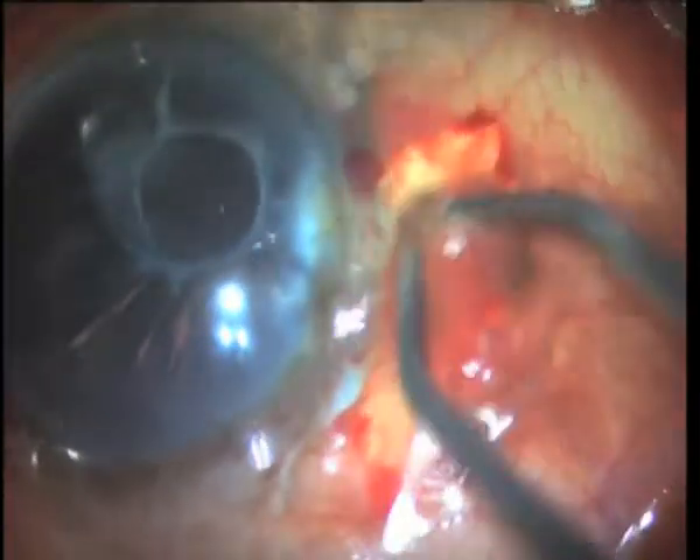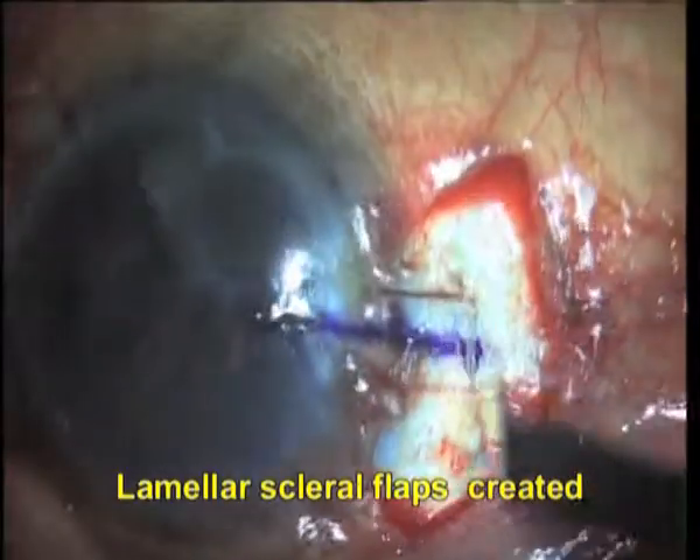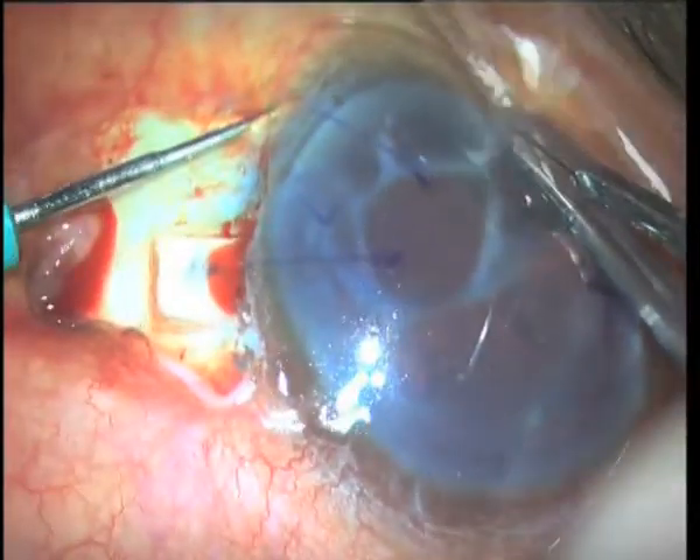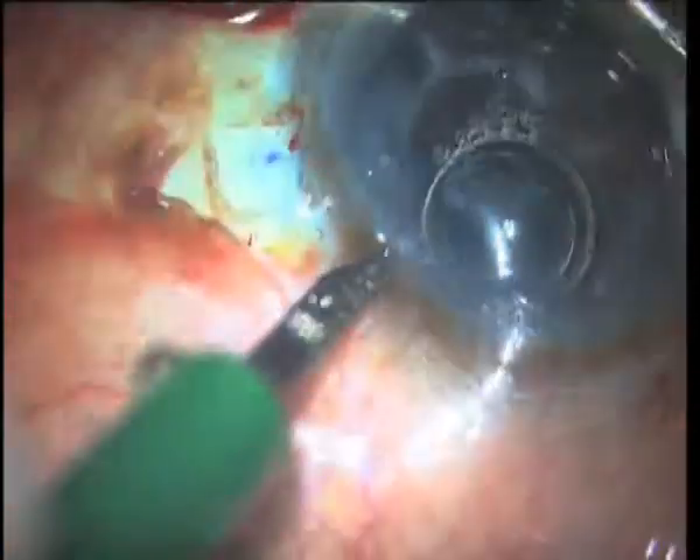We begin with conjunctival peritomy and creation of partial thickness scleral flaps 180 degrees apart in preparation for a glued intraocular lens. A trocar anterior chamber maintainer is inserted and two side port entries are made.